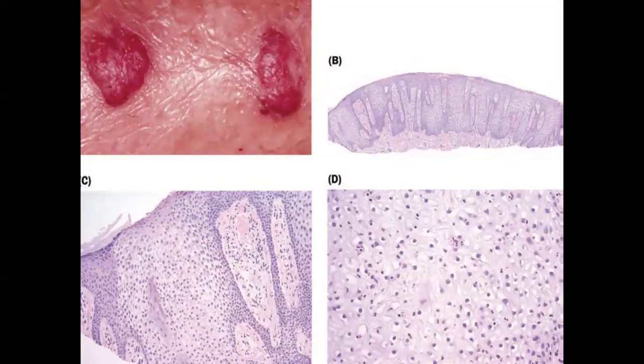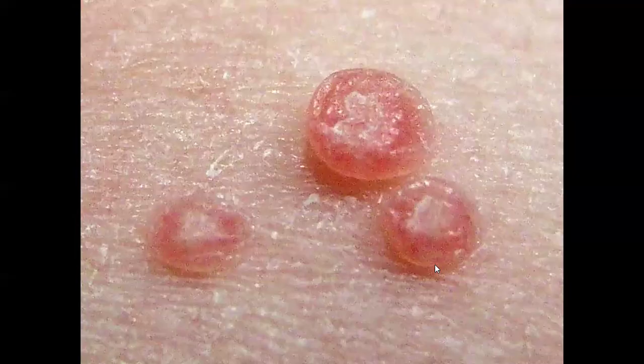An uncommon condition is characterized by red papules and plaques. It is called clear cell acanthoma, and this is characterized by epidermal hyperplasia with clear cells. These clear cells can be separated from the normal epidermis very clearly at the margin of the skin lesion. So epidermal hyperplasia with clear cells is clear cell acanthoma.